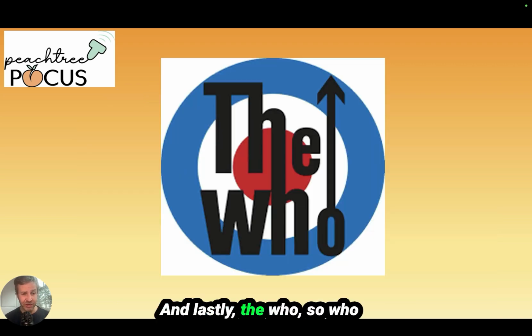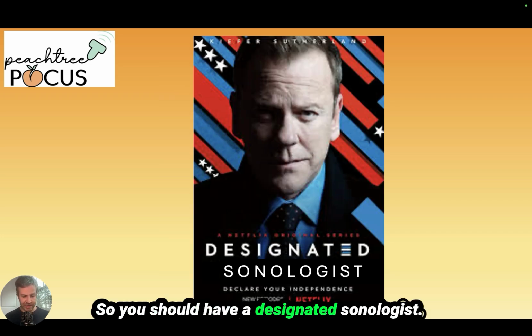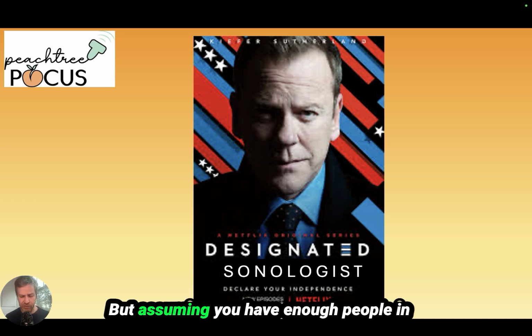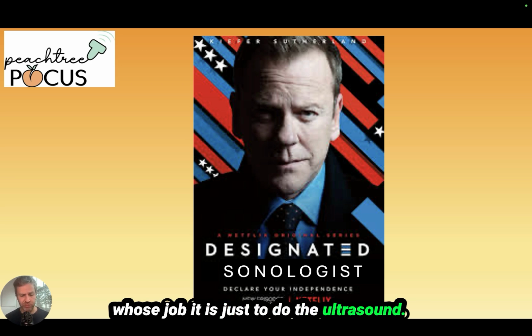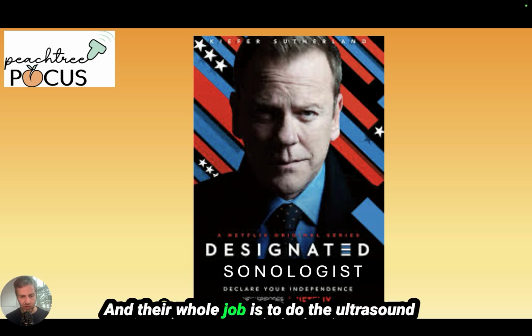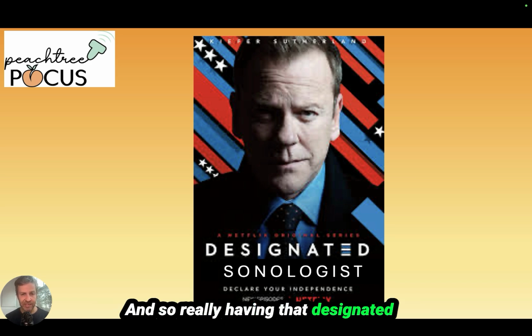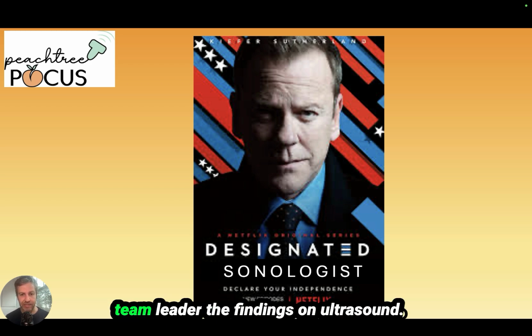All right. And lastly, the who. So who should be doing the ultrasound? So you should have a designated sonologist. So what it means is someone's role in the cardiac arrest. It should not be the team leader. It should not be the person on the airway. But assuming you have enough people in the cardiac arrest, you should have someone whose job it is just to do the ultrasound, to follow through the algorithm that I was talking about. And their whole job is to do the ultrasound during compressions and during the pauses. And so really having that designated person relieves everyone else from being able to do that, and they can then feed back to the team leader the findings on ultrasound.